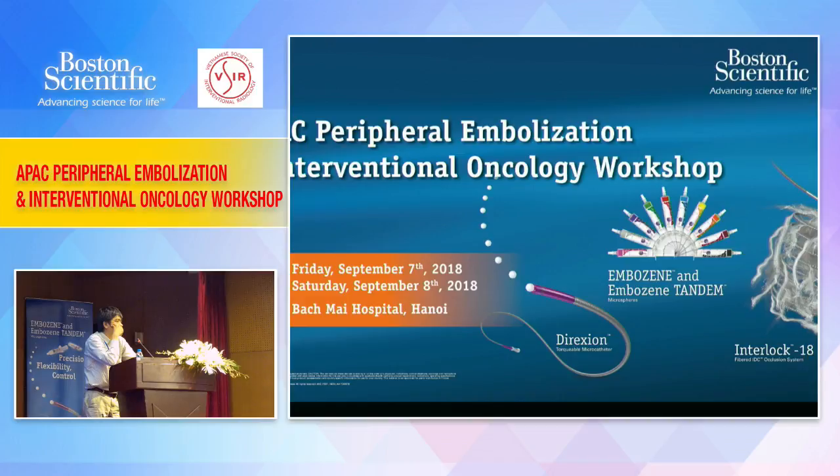Alcohol, you take with the Lipiodol, 60 to 70% is good enough. Don't use pure alcohol, you occlude too prematurely. If the alcohol fails to occlude, next you use glue. Very diluted glue, 25 to 30%, where you can give a very good deep penetration of the nidus, as well as prevent premature adhesion or sticking of your catheter to the pedicle.